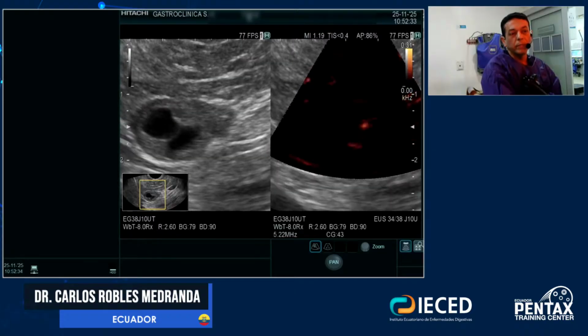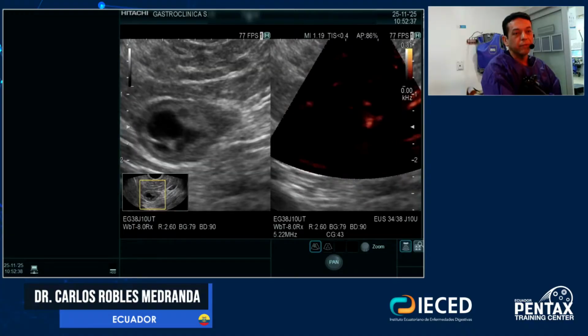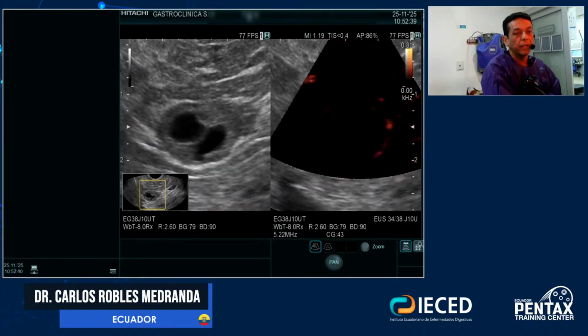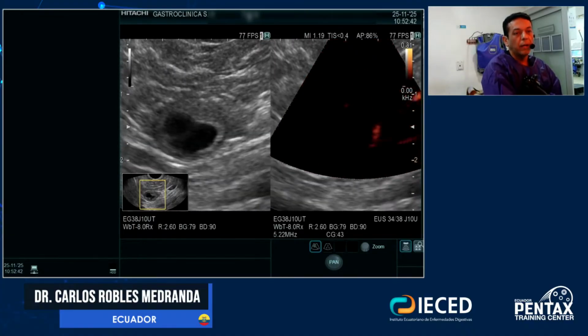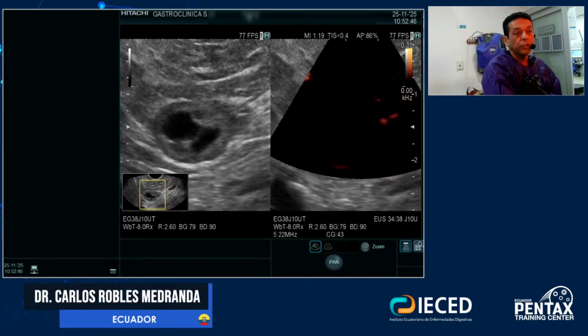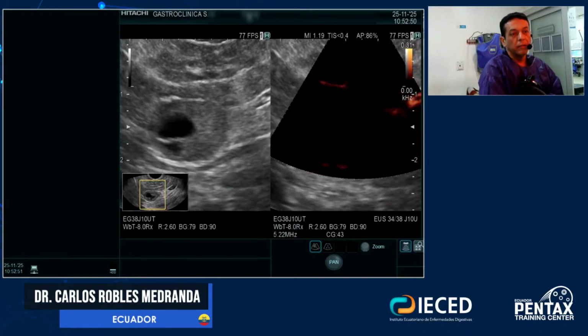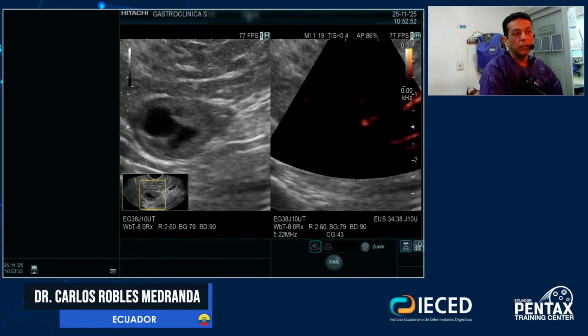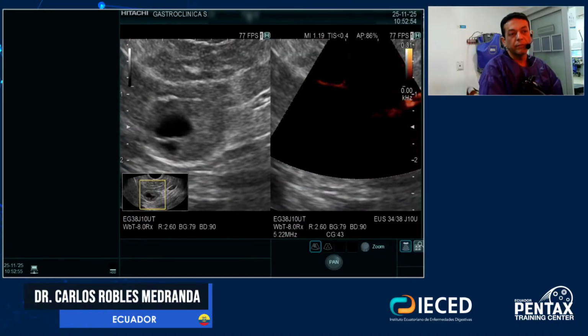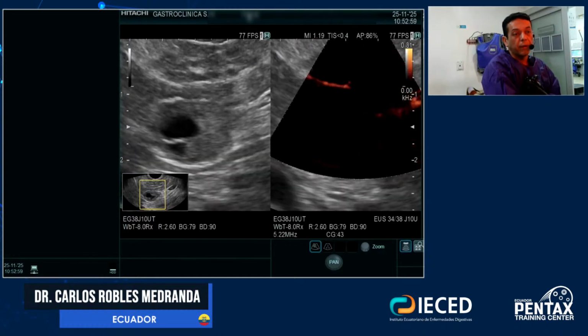First, because we always see it in B mode. Thanks to God, nowadays we have technology and a lot of tools that we can use to evaluate these lesions. Second, because the histologic approach is difficult, the samples are not big, and sometimes there are complications like bleeding, right?